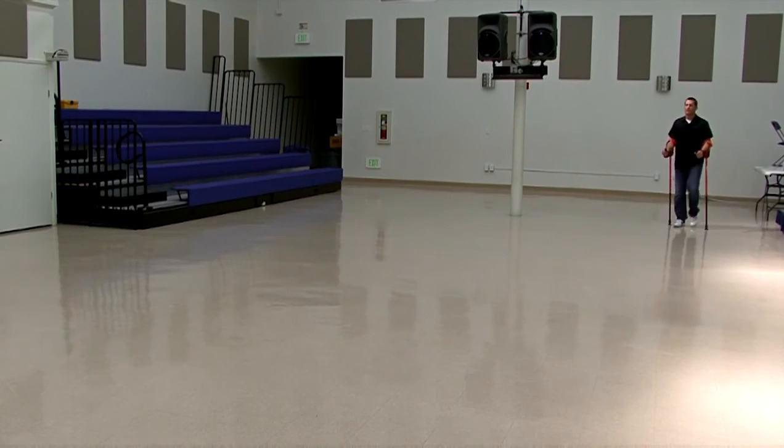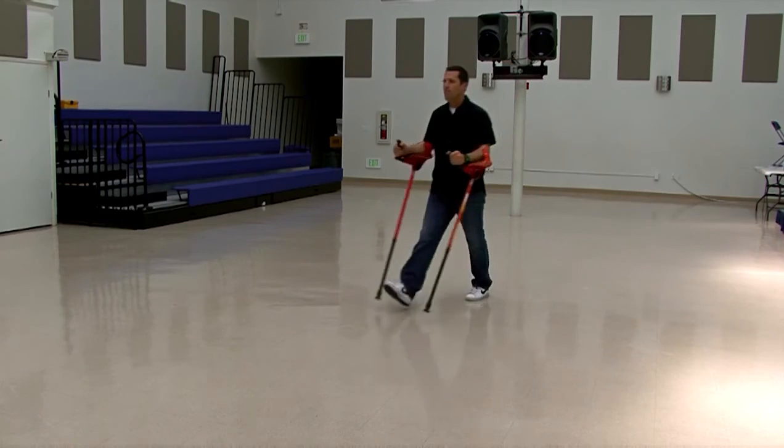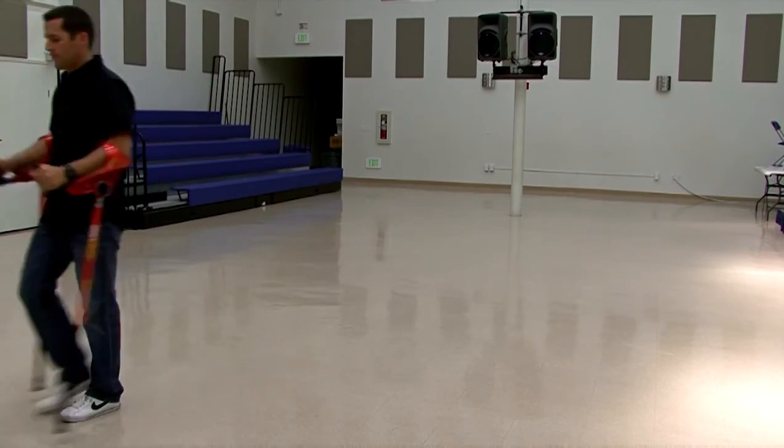If you are using smartCRUTCH for weight-bearing, or what we call assisted walking, you can immediately select an angle setting to meet your personal requirements.